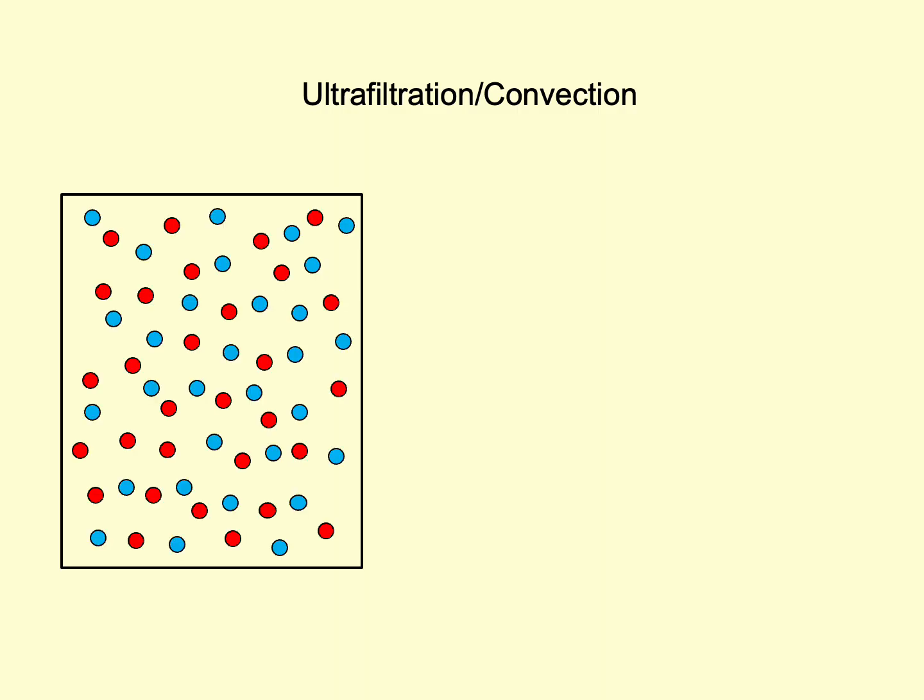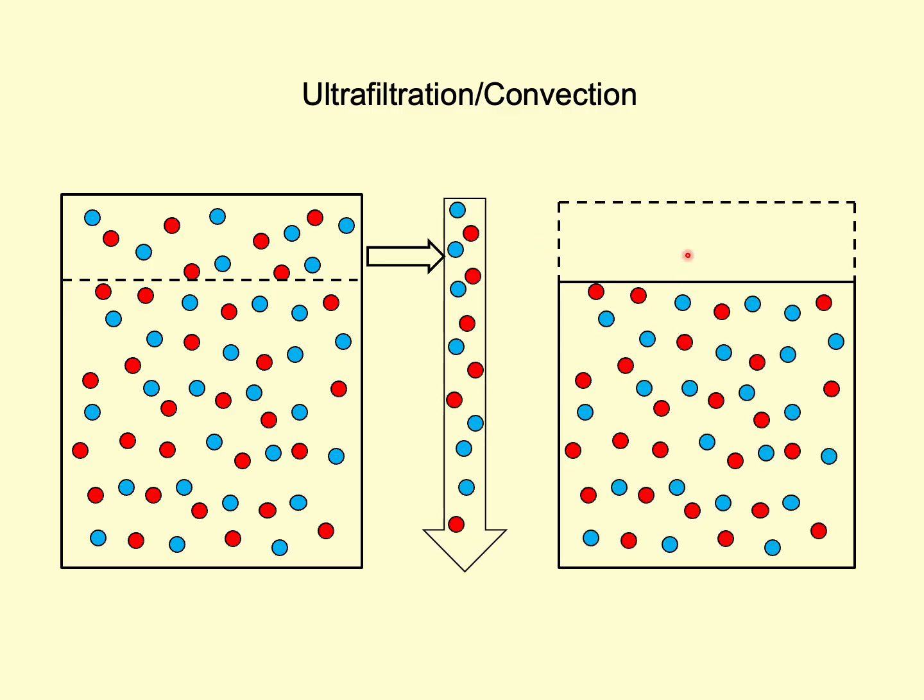But patients with renal failure are also often volume overloaded because their kidneys are unable to get rid of fluid. So plasma volume in these patients can be decreased by ultrafiltration. Here you start with your volume, the water and the toxins, and by applying a negative pressure across the dialysis membrane, you suck out plasma by the process of ultrafiltration and all the molecules dissolved in it by convection, leaving you with a smaller volume, but no change in solute concentration.